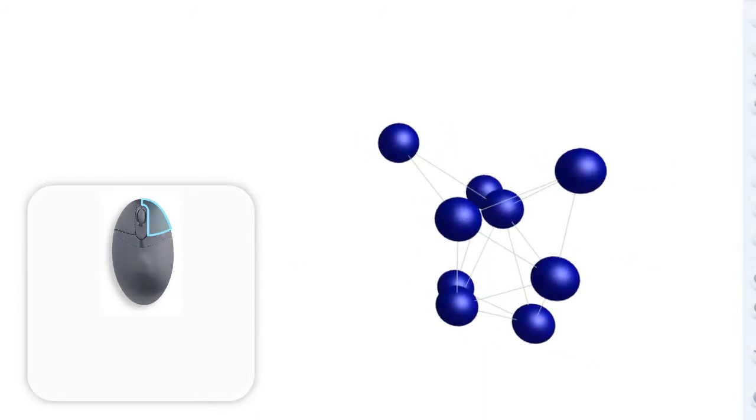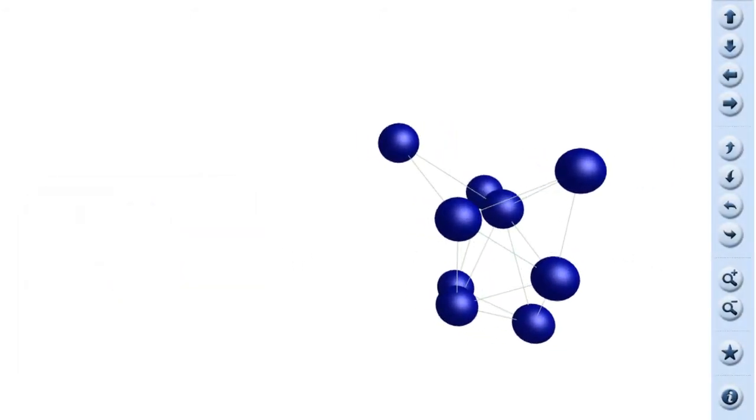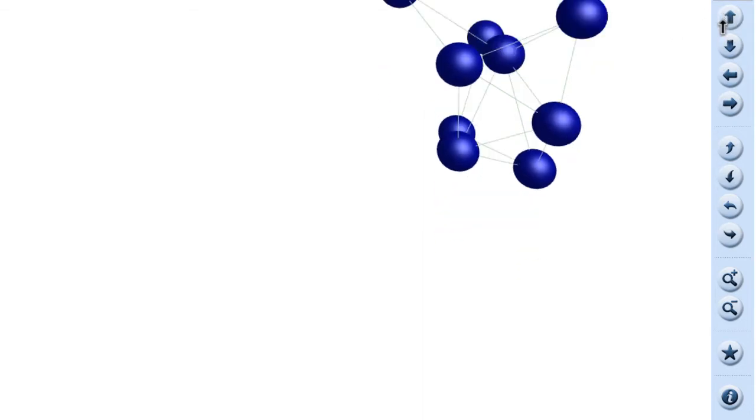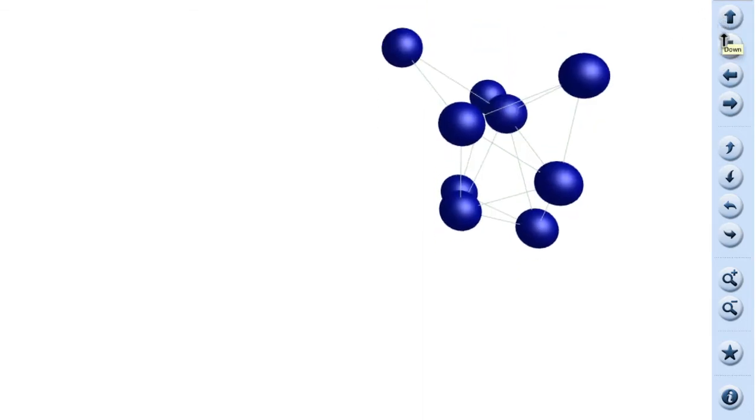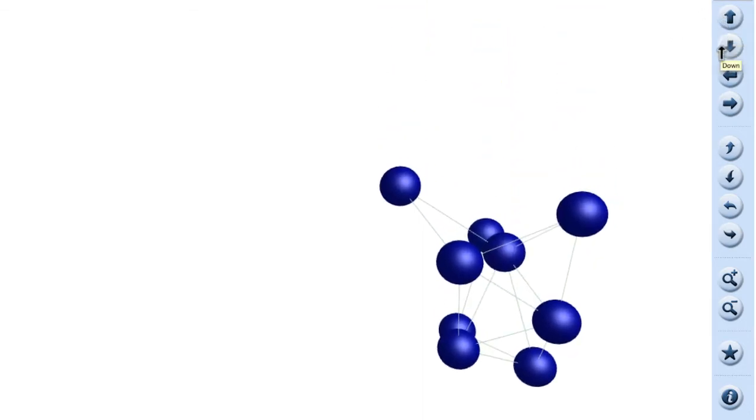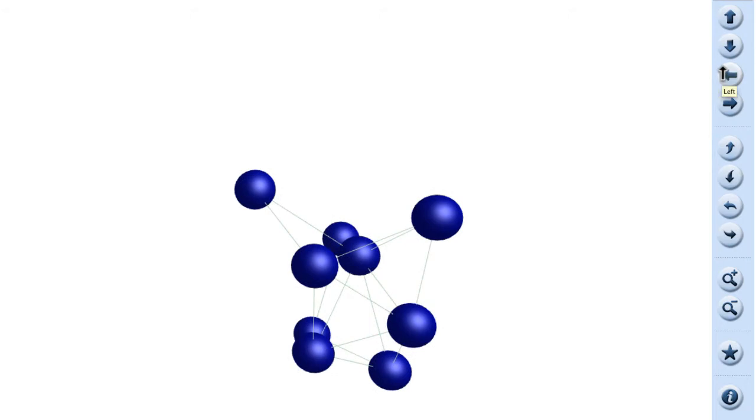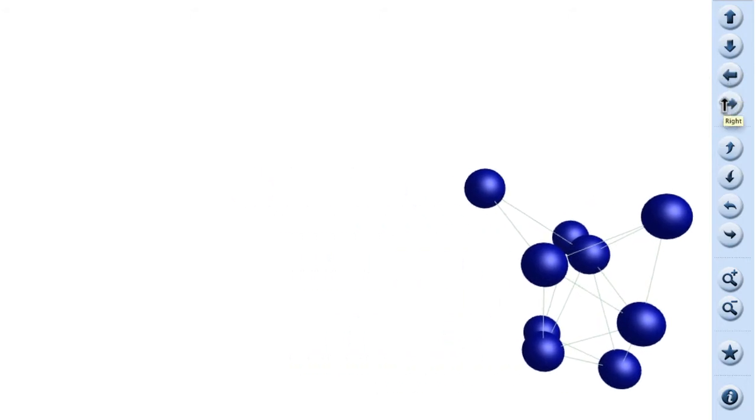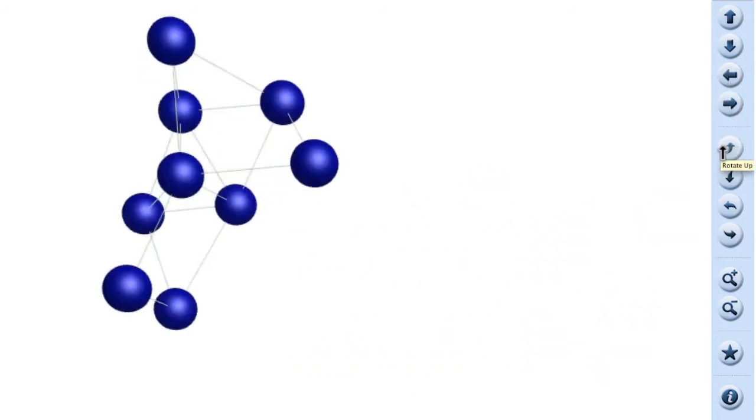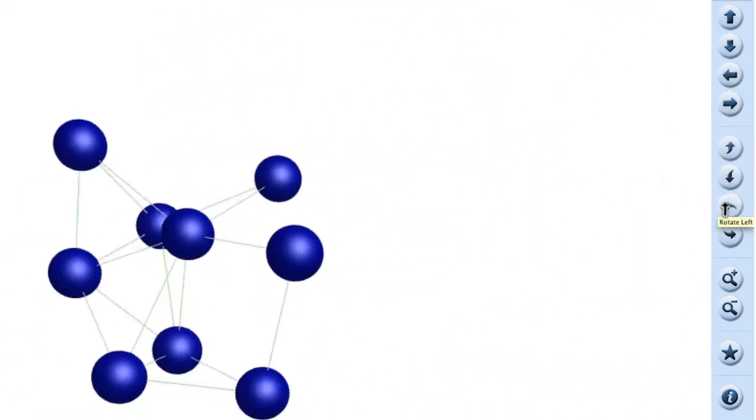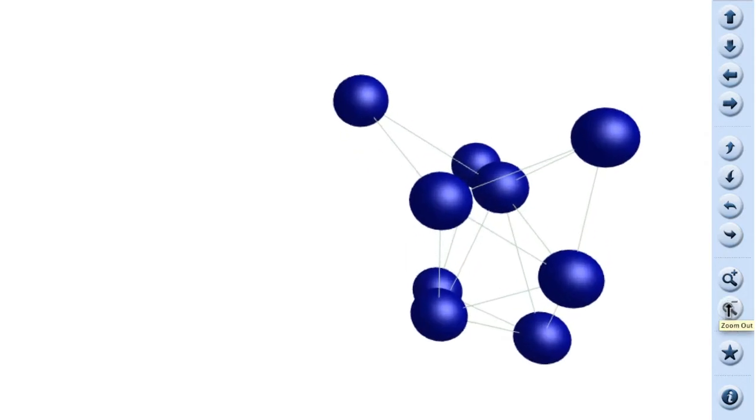All these commands can be found in the navigational bar on the left side of the screen. Translate up, down, left and right. Rotations and zoom in and out.